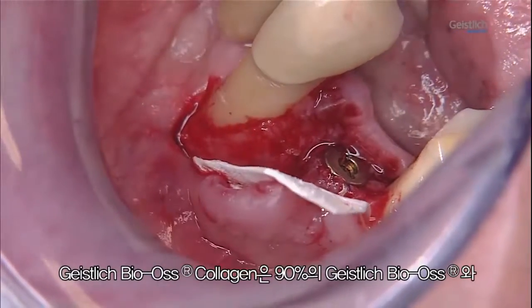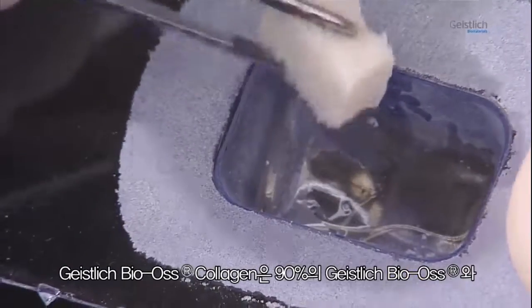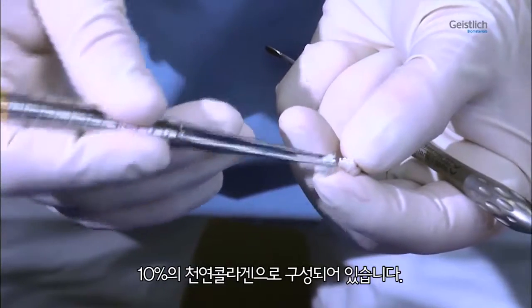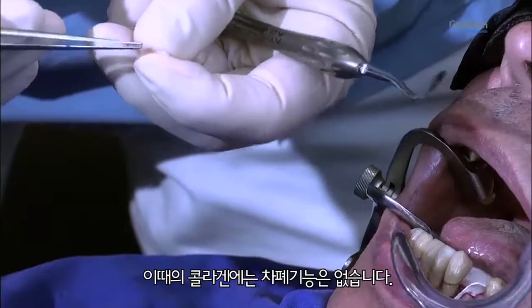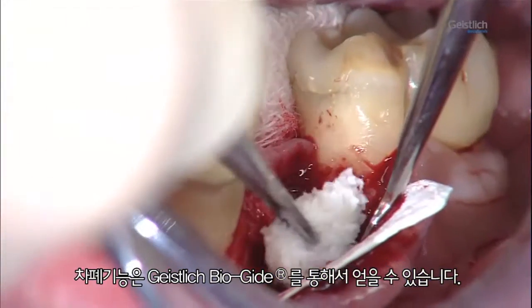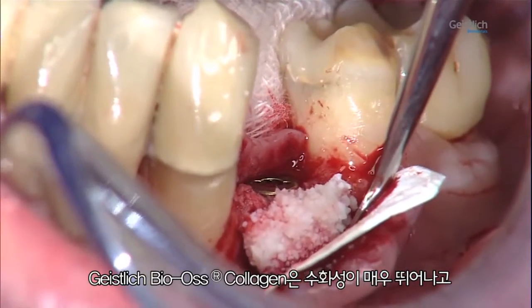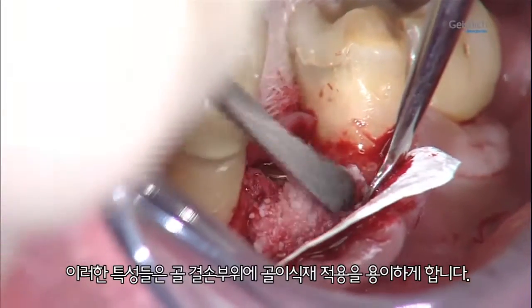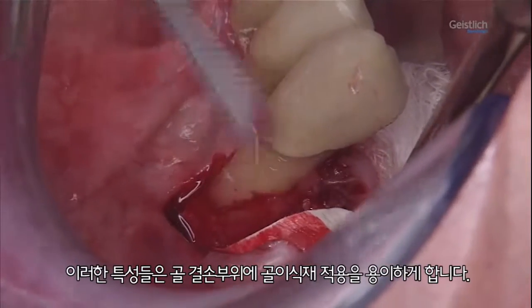The Geistlich BioOs collagen block consists of 90% Geistlich BioOs granules. The remaining 10% is collagen, which holds the Geistlich BioOs granules in the block together. This collagen has no barrier function. The barrier function is provided by the Geistlich BioGuide membrane. The block absorbs liquids very well and is easily divisible and moldable. These properties make the introduction of the bone substitute material into the defect considerably easy.